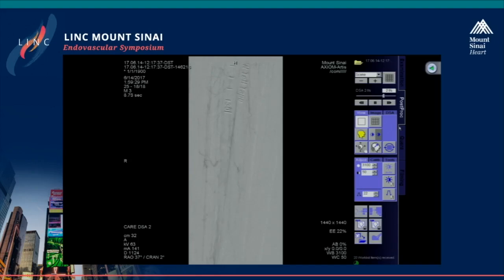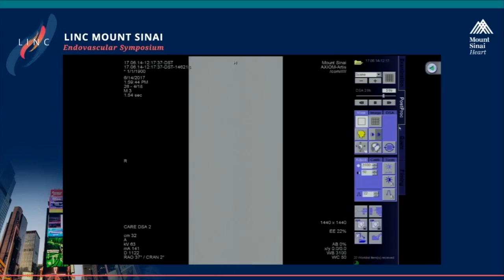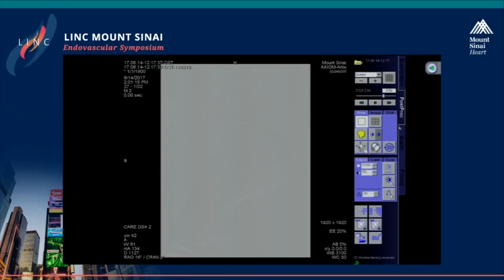That Dr. Kuhn was saying was so important in keeping this leg alive. And then we took a shot of the foot. I think we're going to be very encouraged, actually I got a better picture here. We're going to be very encouraged that she's going to do quite well. So again, I thank you for the support, and thank you for all the great suggestions. Thank you. I think a beautiful result, PK. Any comments?